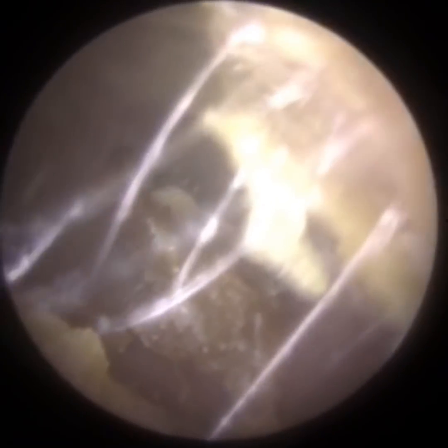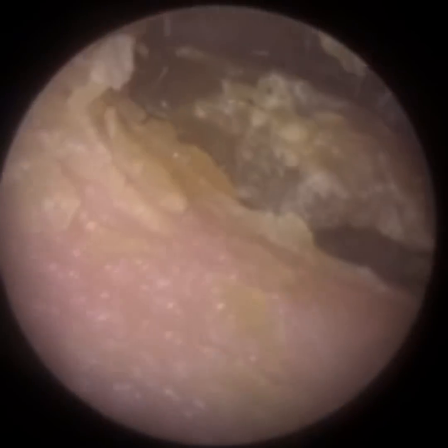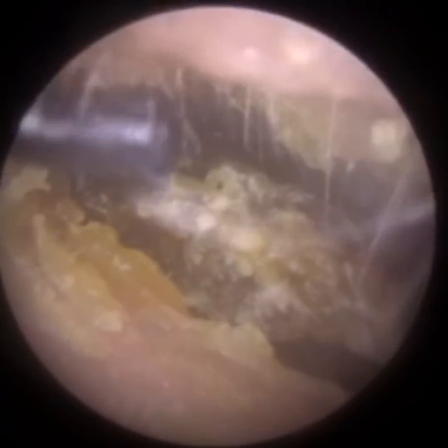Whilst you're watching that, I'll answer some questions from yesterday's video. Someone wanted to know when hairs are plucked from the ear if it's uncomfortable or painful. Patients tolerate it really, really well — it's probably a slight sharp pinch, but that's it. I've never had anyone really complain that it's uncomfortable to the point where I need to stop.